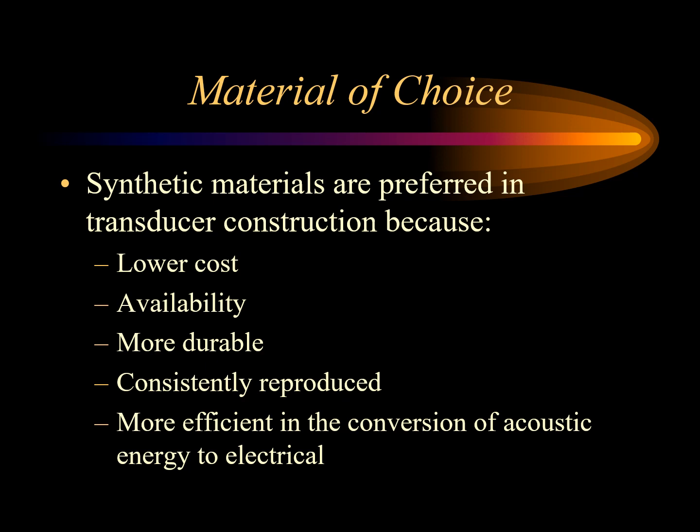Synthetic materials are often preferred in ultrasound transducer construction for numerous reasons. They have a lower cost, they're readily available, they tend to be more durable and can be consistently reproduced, and they're more efficient in the conversion of acoustic energy to electrical energy.